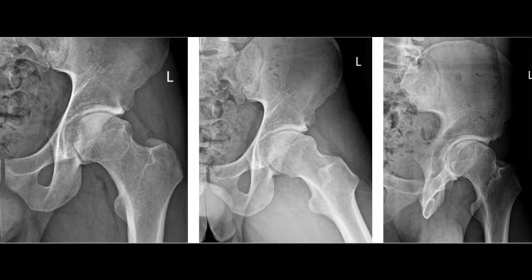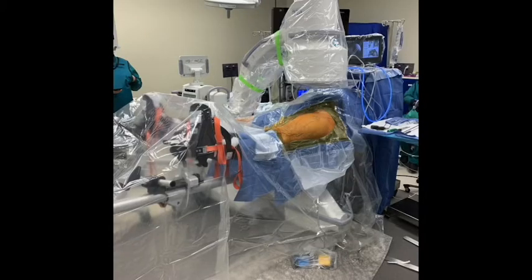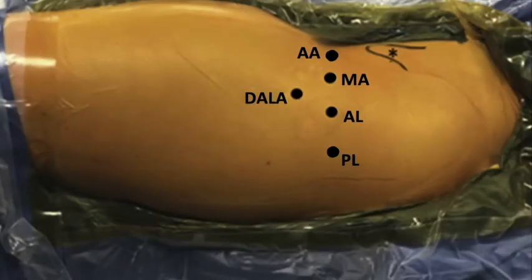After failing conservative management with a minimum of 3 months of physical therapy, injections, and activity modification, the patient was indicated for an arthroscopic hip surgery to treat intra-articular, both central and peripheral compartment injuries. The patient was placed supine on the operating room table with the fluoroscopic imaging displayed here.